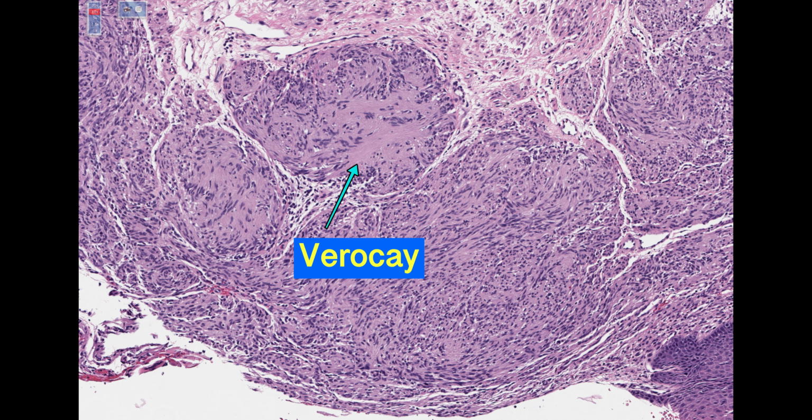So the diagnosis was very typical for a schwannoma, a tumor that is relatively common in head and neck, not an atypical cellular schwannoma or malignant peripheral nerve sheath tumor, completely excised with margins apparently negative, but I always recommend in a comment follow up, because even after successful removal, schwannomas recur in 5% of the cases.